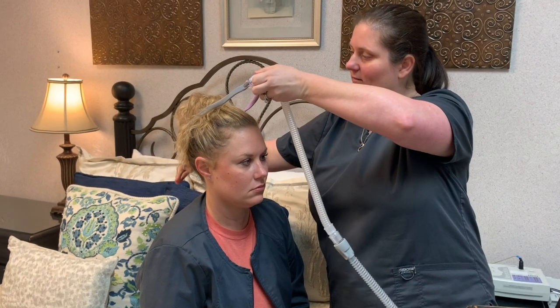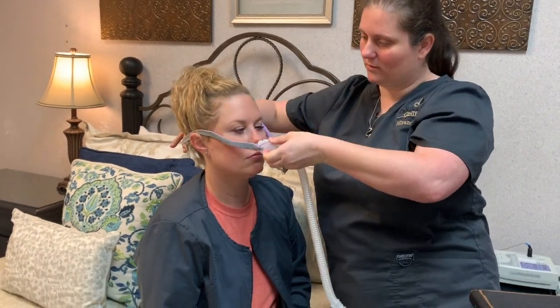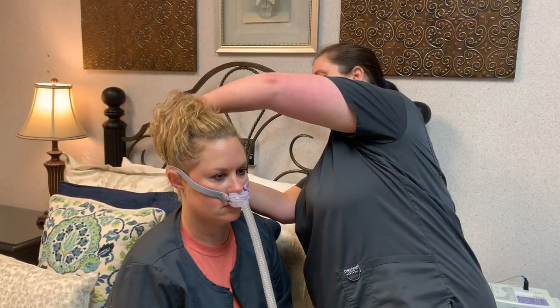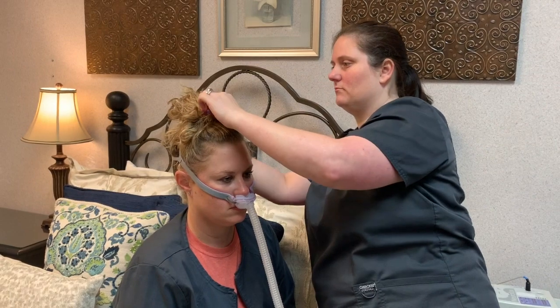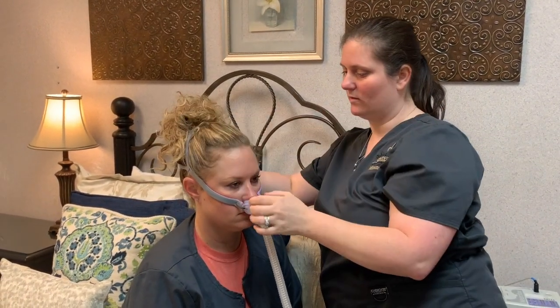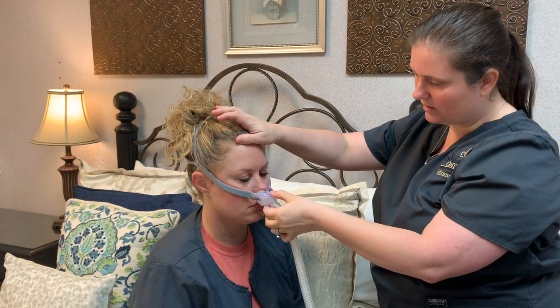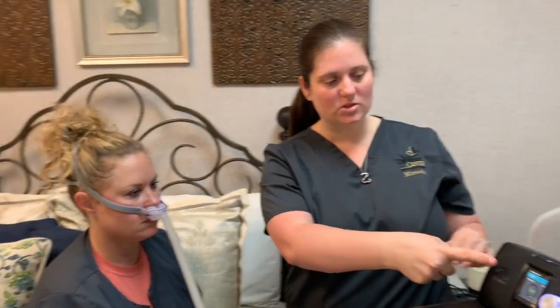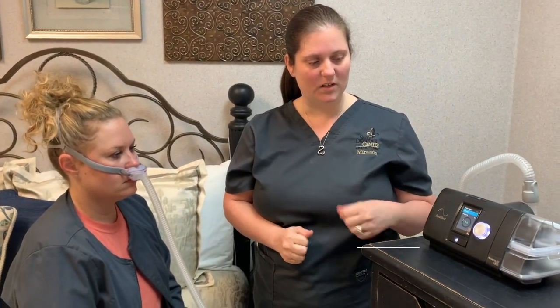Now we'll go over the headgear. Place it into the nostrils — we'll separate these like so, one at the top, one at the bottom, and then just pull down and readjust into the nose.